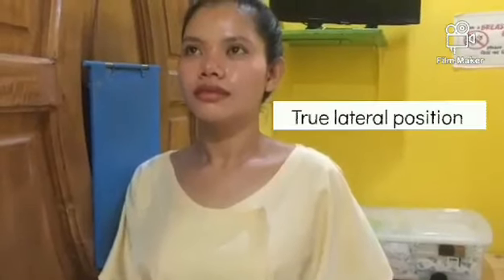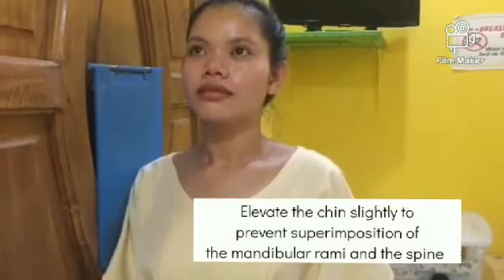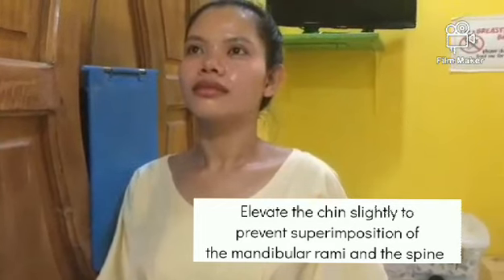Adjust the body in a true lateral position with the long axis of the cervical vertebrae parallel with the plane of the film. So elevate the chin slightly to prevent superimposition of the mandibular rami and the spine, and with the mid-sagittal plane of the head vertical, ask the patient to look steadily at one spot on the wall to aid in maintaining the position of the head. Direct the central ray horizontally to the fourth cervical vertebra.